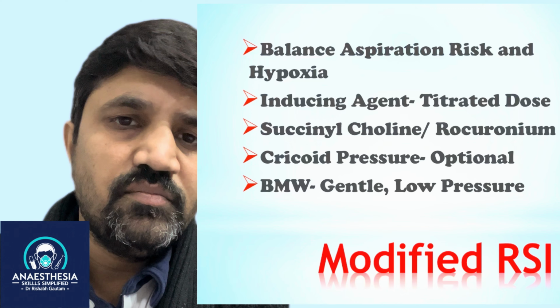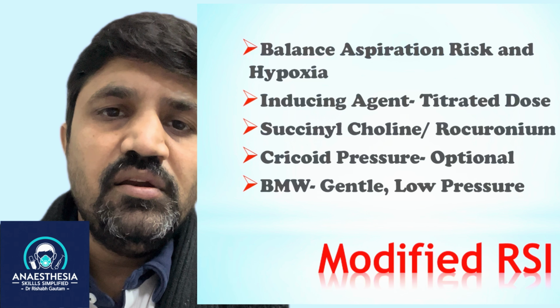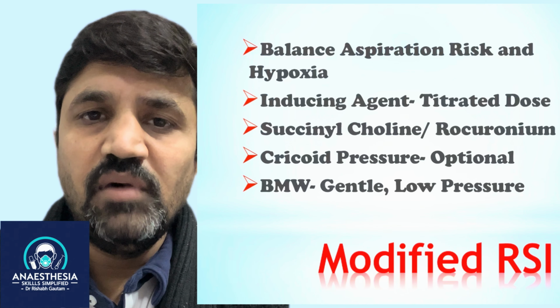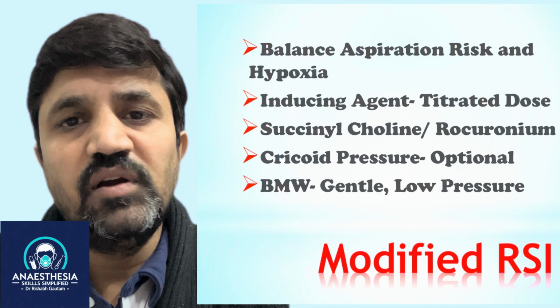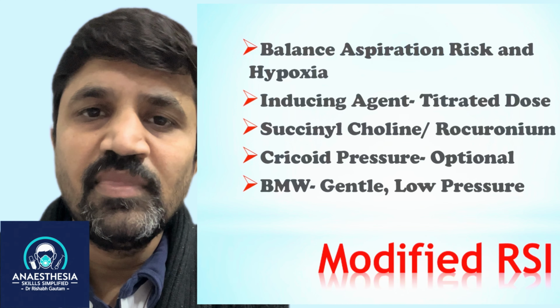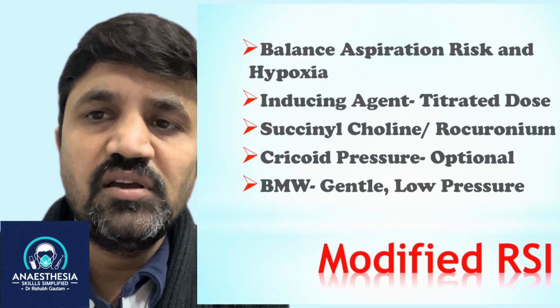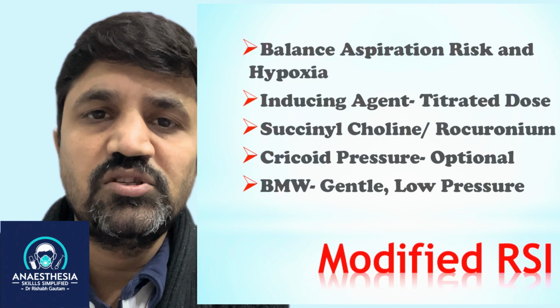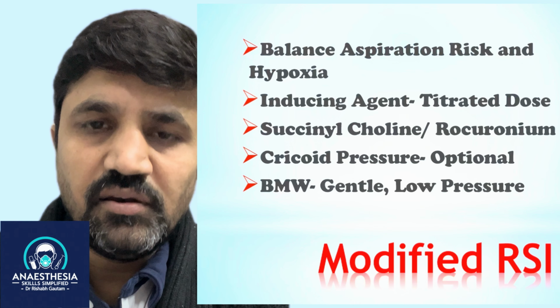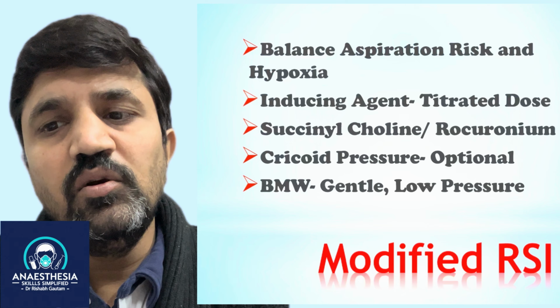Another change in modified RSI is about the bag mask ventilation. In classic RSI, there is no scope of bag mask ventilation. There is no bag mask ventilation in classic RSI. But in case of modified RSI, if you feel the patient is having hypoxia or is desaturating, then you can use bag mask ventilation with gentle and low pressure.